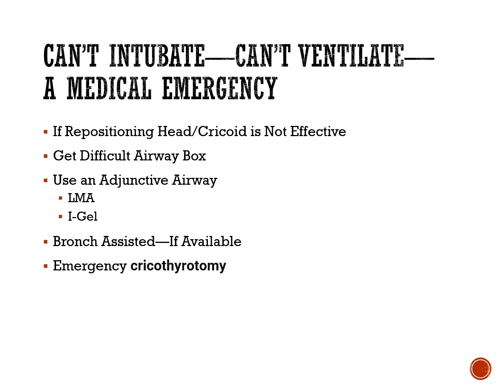If that's not effective, get the difficult airway box, have somebody open it up, and use an adjunctive airway: an LMA, laryngeal mask airway, or an i-gel, or bronchoscope assisted intubation, and in emergency cases, an emergency cricothyrotomy. We're actually putting a hole in the throat. They're in rare cases done in the field, and occasionally they're done in acute care hospitals as well. You should not attempt to do that. It really would be a surgeon, an anesthesiologist, or at a minimum, the attending pulmonary critical care physician.